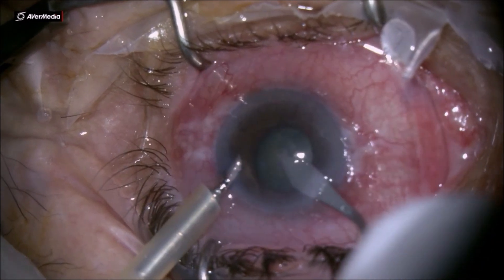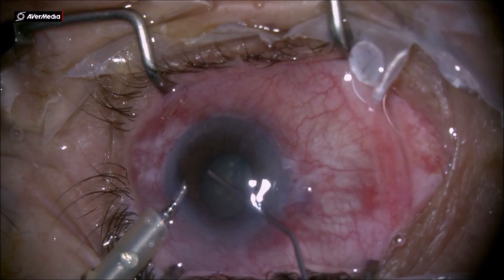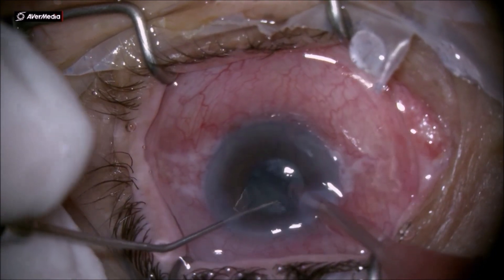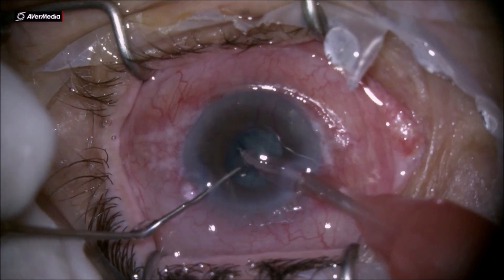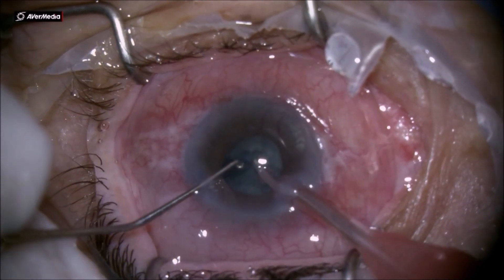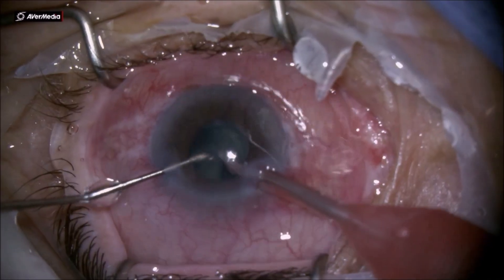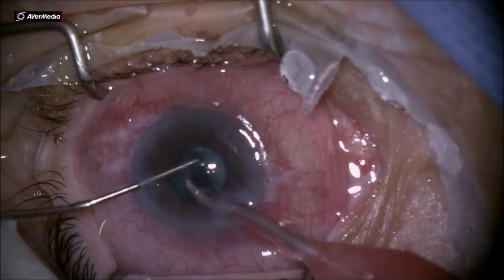As you can see from the high IOP, I have a hazy cornea. At the beginning of the surgery, in order to get a little more dilation on this pupil, I use a spatula to break the posterior synechiae. It is very important in this case to have a capsulorhexis larger than the pupil, which will make the surgery a little bit easier.